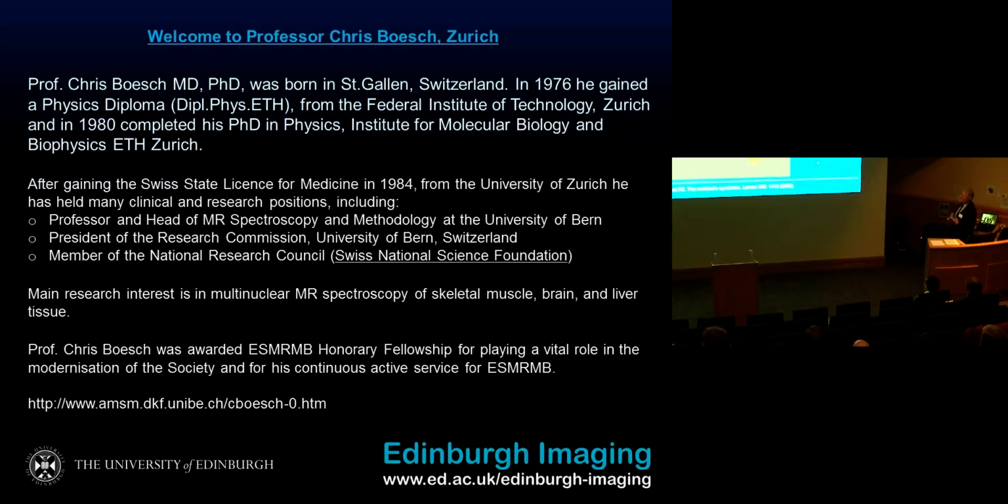Pancreas. In the pancreas we have lipids. However, a study from the Düsseldorf group, Roden and co-workers, has shown that there is no relationship between pancreatic adipose tissue infiltration and beta cell function. Here spectroscopy has the problem that the moving organ poses some problems, because as soon as the voxel is once or twice in the adipose tissue surrounding the pancreas, we have a strong lipid signal, while the imaging techniques help us to distinguish the surrounding adipose tissue and the pancreas. So here I would even argue for MRI and Dixon techniques.